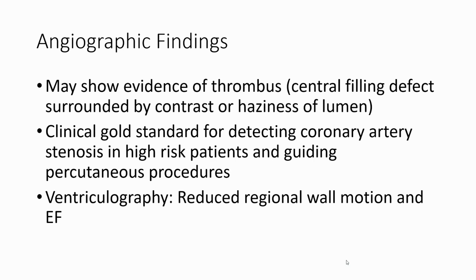It is the clinical gold standard for detecting coronary artery stenosis in high-risk patients and guiding percutaneous procedures. Ventriculography: reduced regional wall motion and ejection fraction.